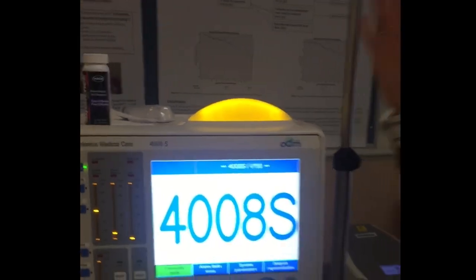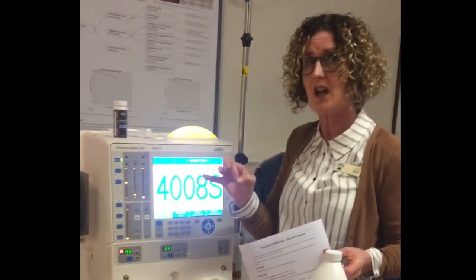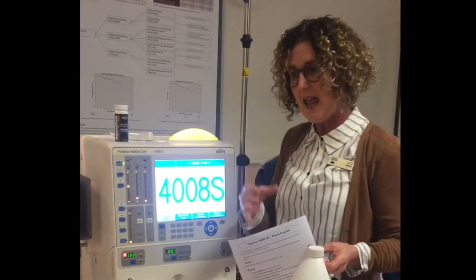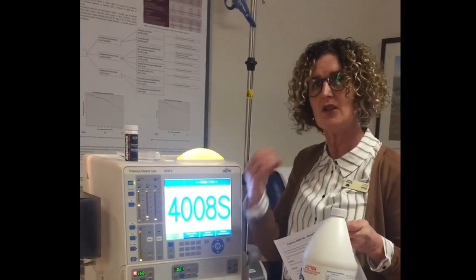Today we're going to bleach the Fresenius dialysis machine. The reason we put bleach down the machine is to reduce the risk of biofilm collecting in the drainage lines. If that biofilm builds up too much, it can actually block your drains.